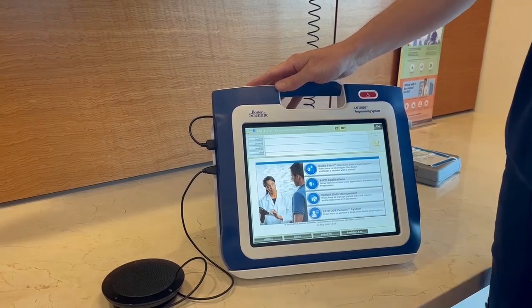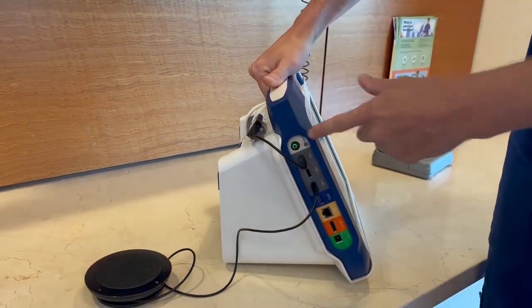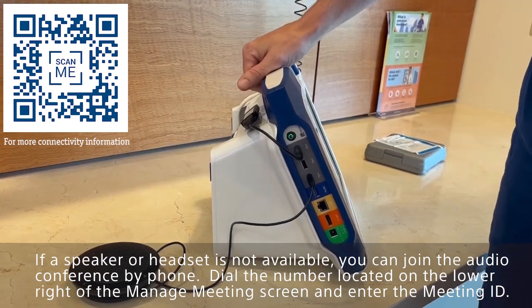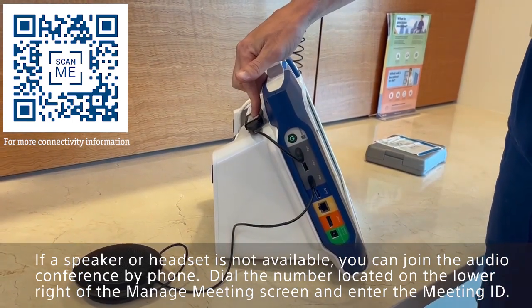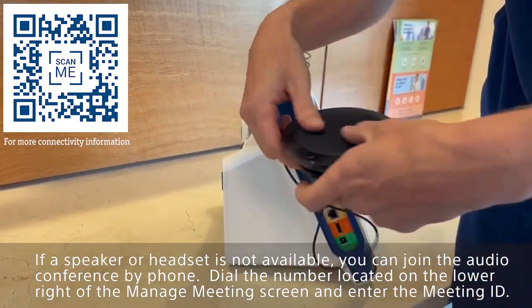Let's first get familiar with the 3300 programmer. On the side here, you'll see the on-off switch, and I've got a 4G cellular adapter plugged in for connectivity. We can also be logged into the Wi-Fi and connect to the local network. This is a conference speaker — I would highly recommend getting one of these as well.